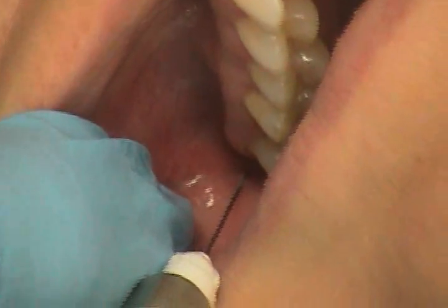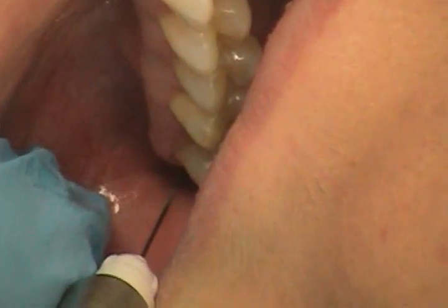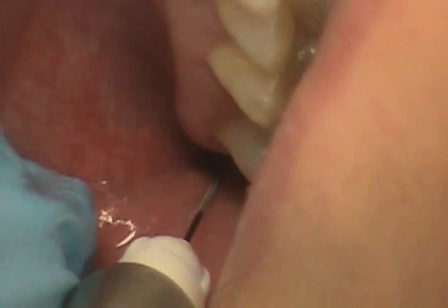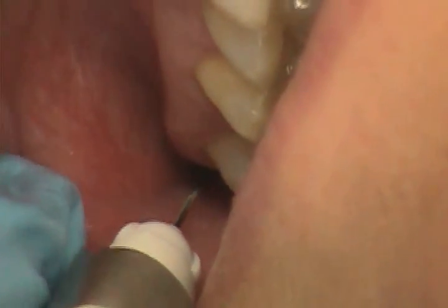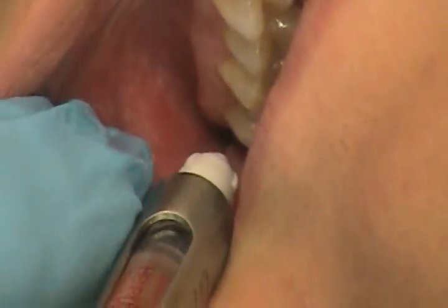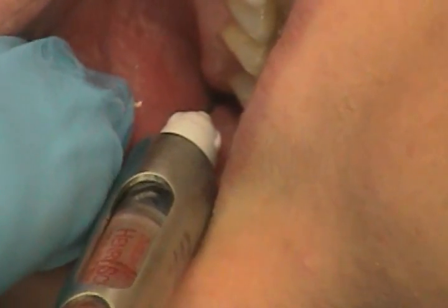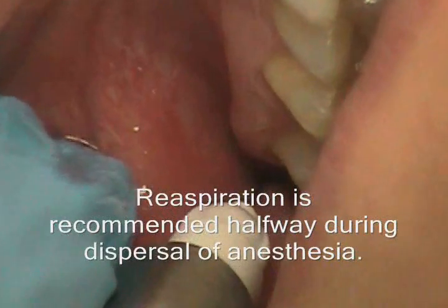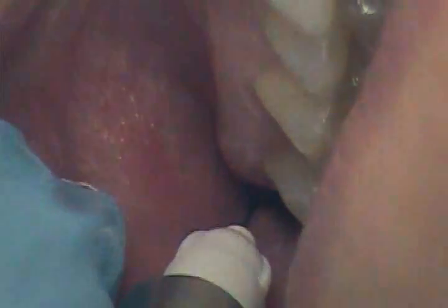Insert the needle to the height of the mucobuccal fold over the second molar. The bevel orientation faces towards the bone. There is no pressure anesthesia. The depth of insertion is about 16 millimeters for a normal adult, or half of the long needle. A short needle equals 4 millimeters and it should remain visible. There is no osseous contact. Aspiration potential is 3.1%. Aspiration negative, and the amount of solution is 0.9 to 1.8 milliliters over 30 to 60 seconds.